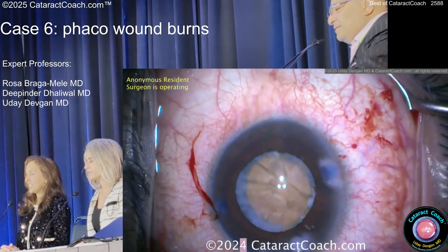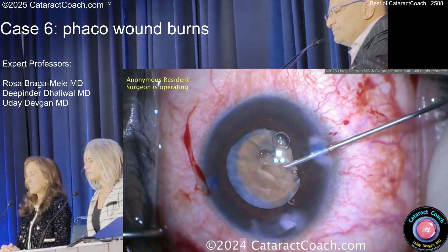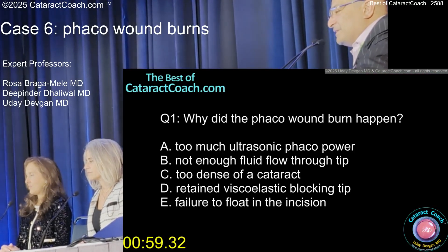What do you see in there? It's burning. And now that's going to leak like stink the whole case, so I'm actually taking over here and we're going to do a small tunnel.